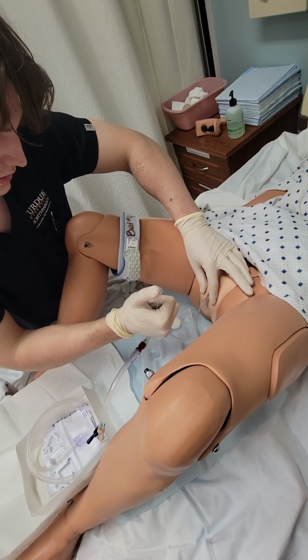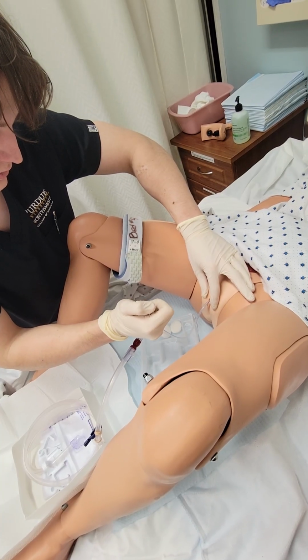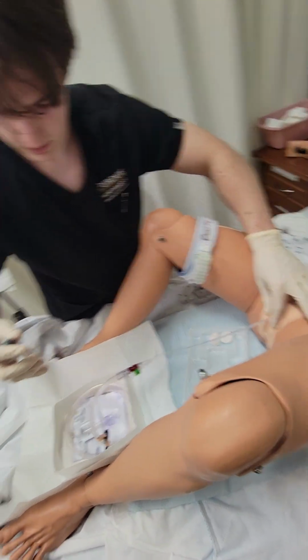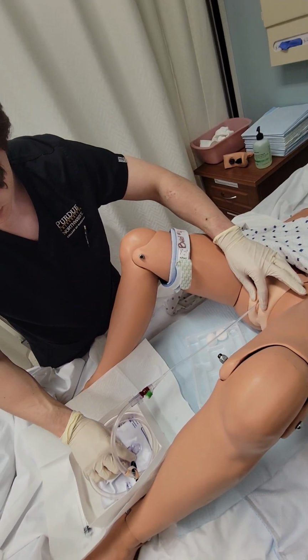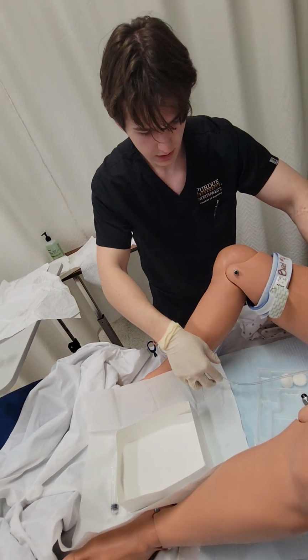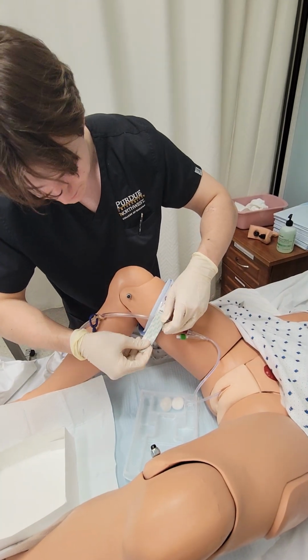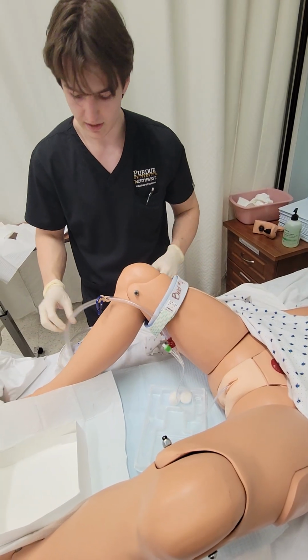And then insert this. And then maneuver it in such a way that I remove it with my sterile hand. And then I can set that over there. All right, so now that is inserted, I will bring the bag over here. Now, since I will no longer be dealing with this, I'll give it a nice little tug. It is in there. Let me give it a little extra slack so it doesn't end up causing some discomfort, and then the patient will be able to lower their leg without it tugging out. So now it is nice in place.